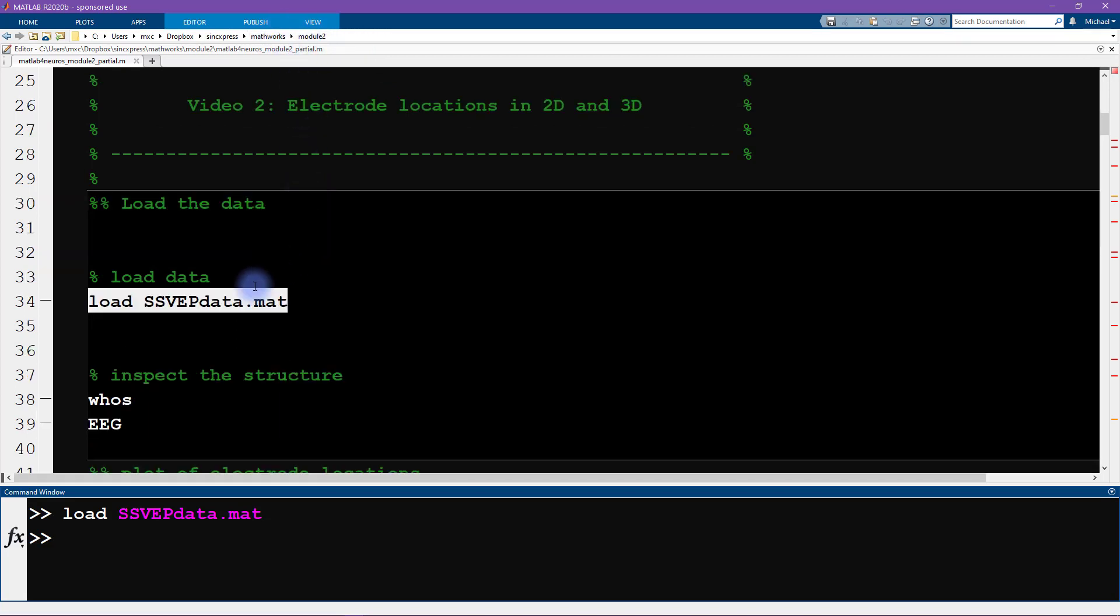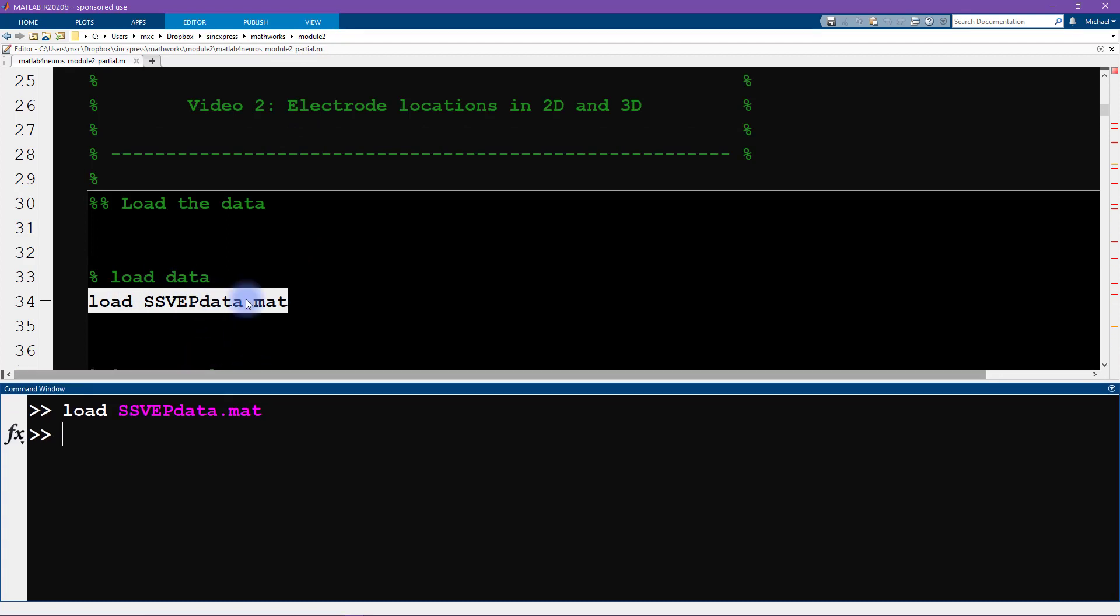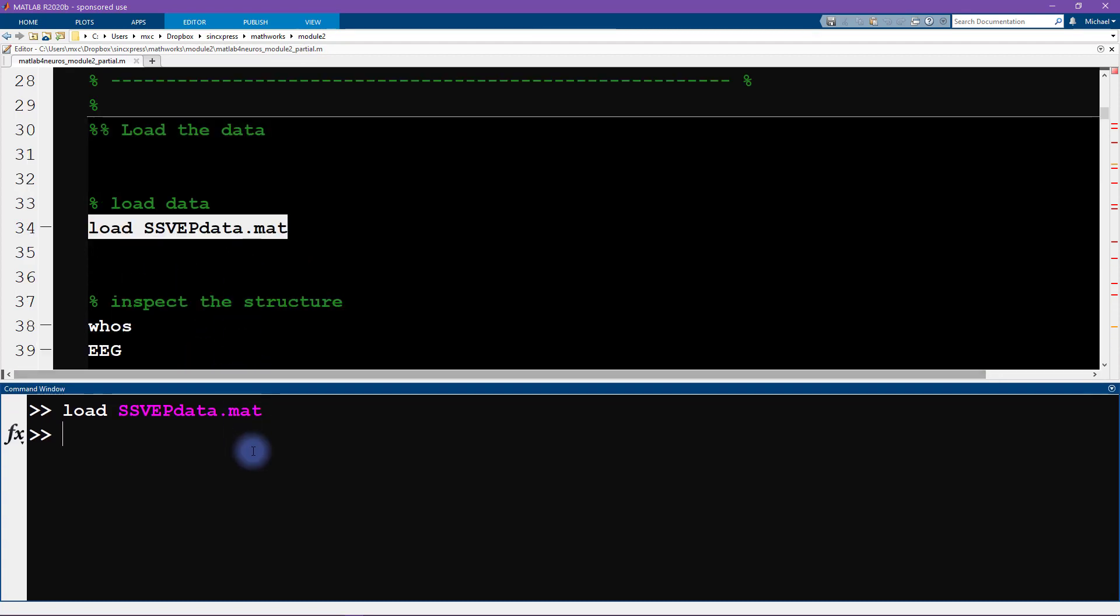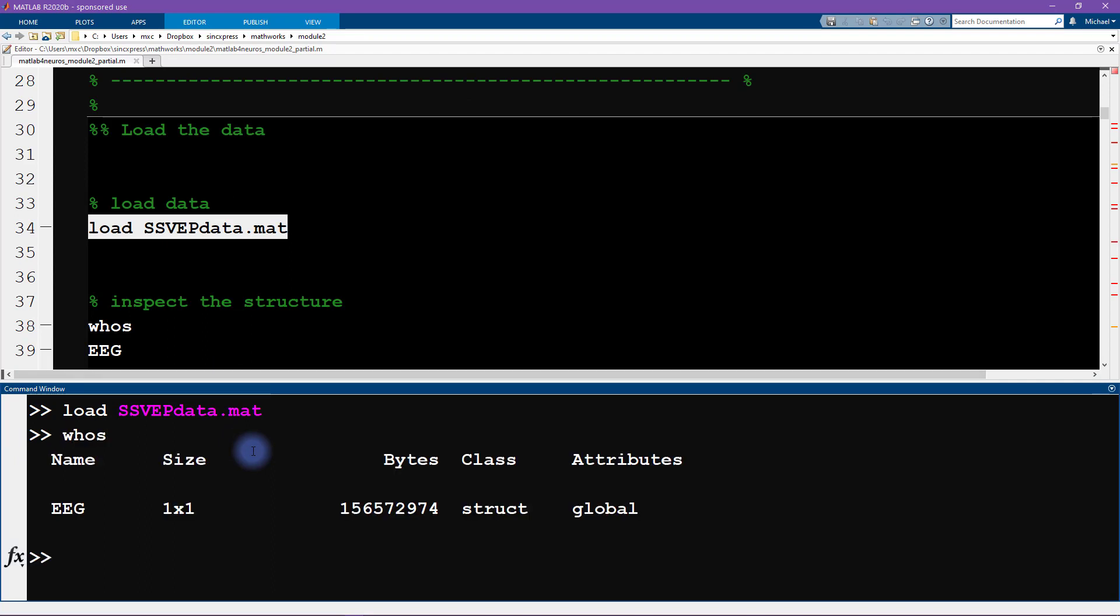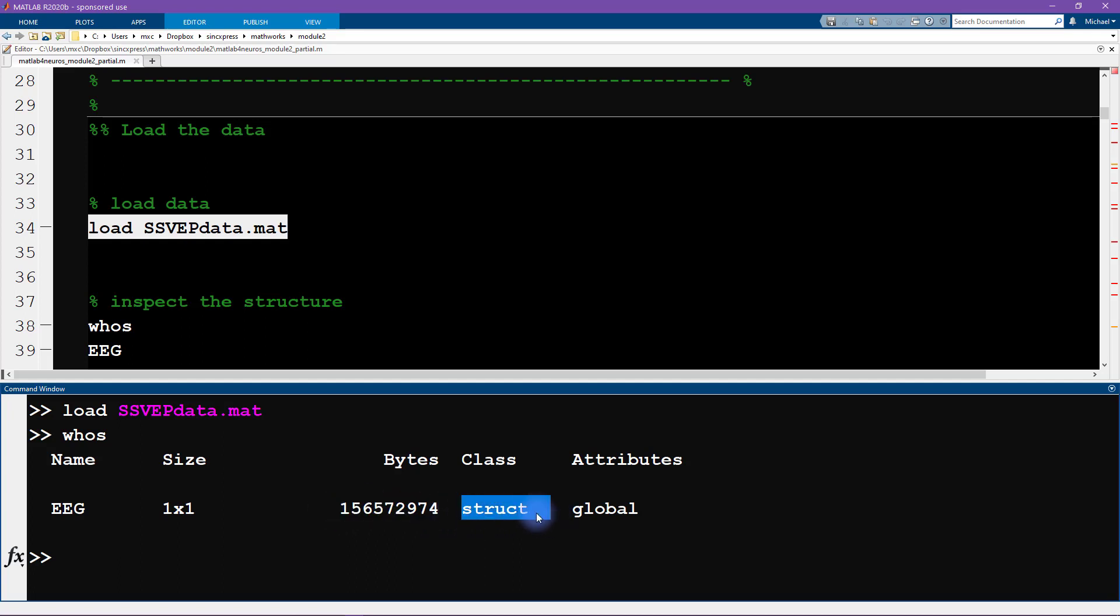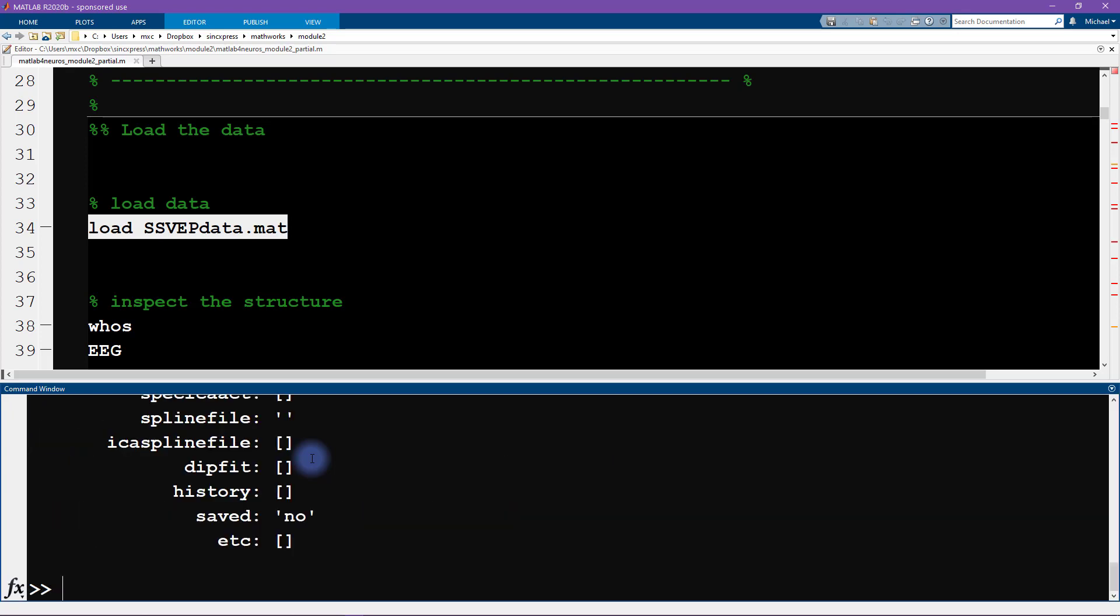Now anytime you load in a new data file it's useful to inspect what was imported. So we type whos to see what is contained inside that mat file. It's just one variable, it's a structure, it's quite big. We've already worked with structures in the previous module. So let's have a look at this one.